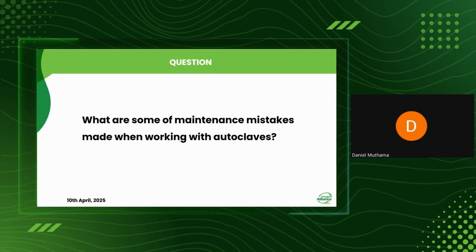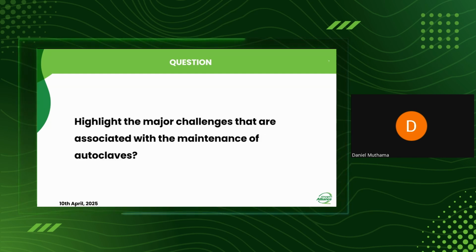This is brought by an overpressure issue. It is brought about when a user leaves the equipment unattended. He or she will switch on the equipment and then leave it working. You will find that the equipment will continue heating, and at that point it can lead to an overpressure issue. Engineer has talked about the safety valve. Sometimes there is interference with that safety valve. It can be user interference, it can be technical interference. When you take it, it has a seal, but sometimes our technicians or the users interfere with that seal. When the equipment is working and that safety valve has been interfered with, there is likelihood of pressure coming out.